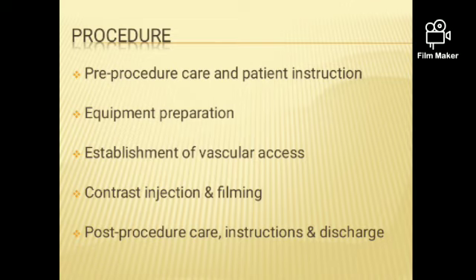We have pre-procedural care. Pre-procedural means the care which is given to the patient prior to the study, that is checking of vital signs, changing the dress, cleaning the area of puncture. That is the pre-procedural area. Then patient instruction, what you are going to do, and filling up of the informed consent form.